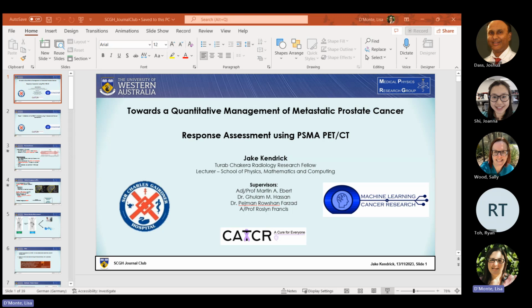Okay, so the patient cohort: we had access to 199 patients with baseline and follow-up scans. They were biochemically recurrent prostate cancer patients. So biochemical recurrence is defined as one of either of those two things following definitive primary treatment for the primary lesion, so radical prostatectomy or radiotherapy. There was a median of 6 months between the baseline and follow-up scans, and patients were either negative or oligometastatic on conventional staging imaging. So we're talking about bone scintigraphy and abdomen and pelvic CT scans.